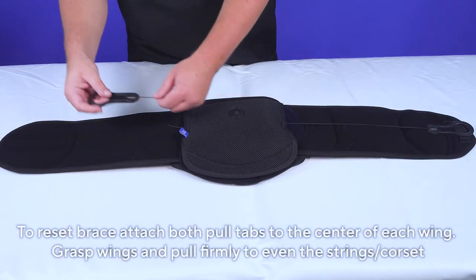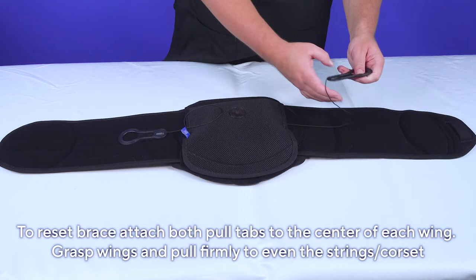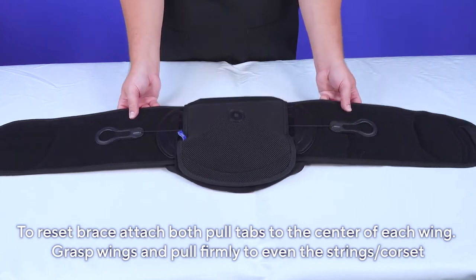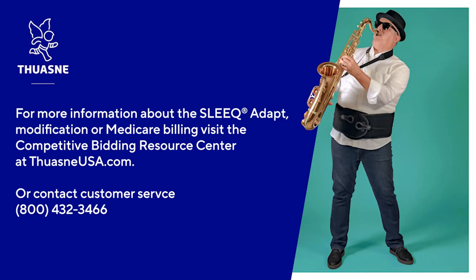To reset the brace, attach both pull tabs to the center of each wing. Grasp the wings and pull firmly, evening out the tab strings and corset. The brace is now ready for application. For more information about the SLEEQ Adapt, brace modification, or Medicare billing, visit the Competitive Bidding Resource Center at ThuasneUSA.com or call customer service at 1-800-432-3466.